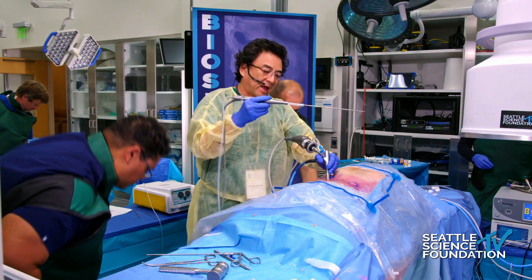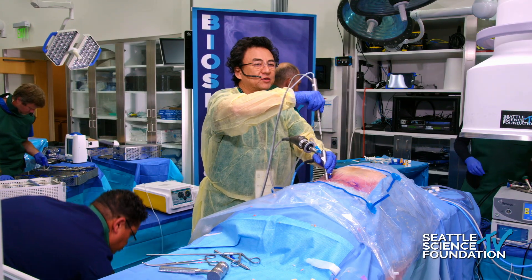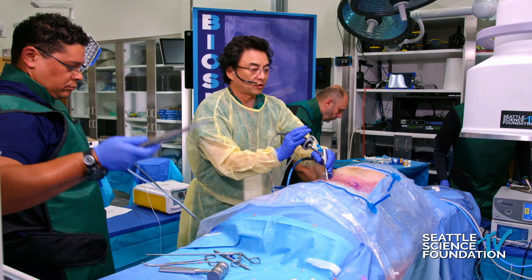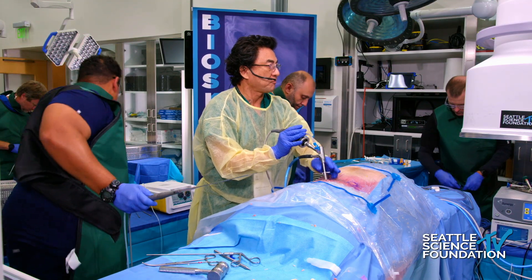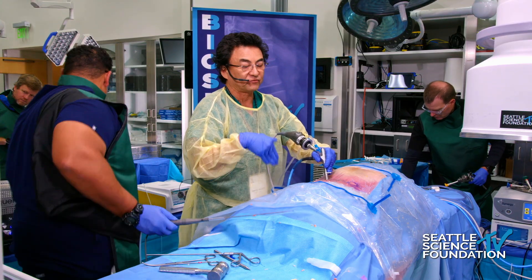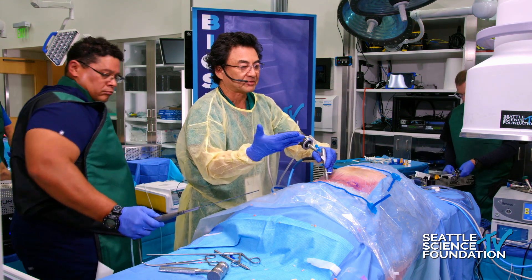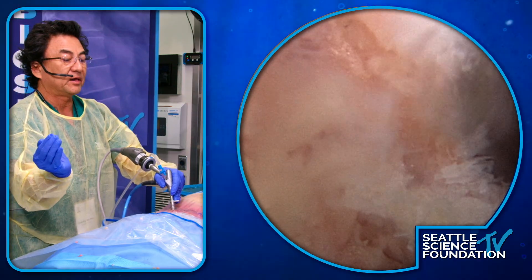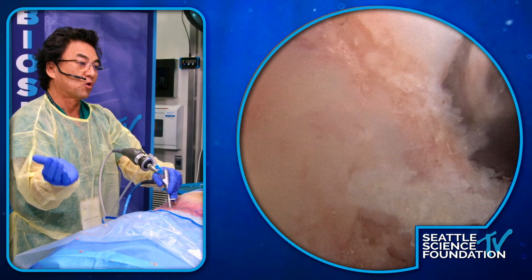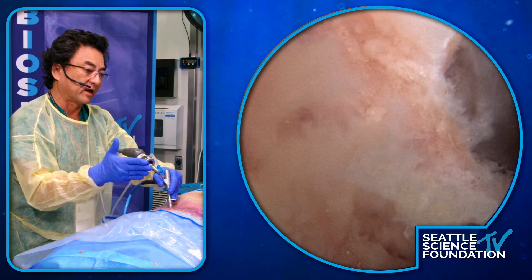I really like using this for doing that superior articular facet resection during a foraminal decompression. There are times where I'm working literally right next to the exiting nerve root — for example, in L5-S1 bony foraminal stenosis with disc base collapse — and the tip of the superior articular process will hook into the exiting nerve root, so you want to resect that whole thing.